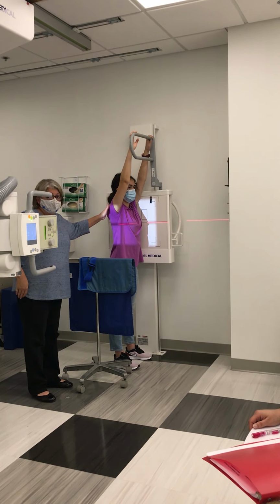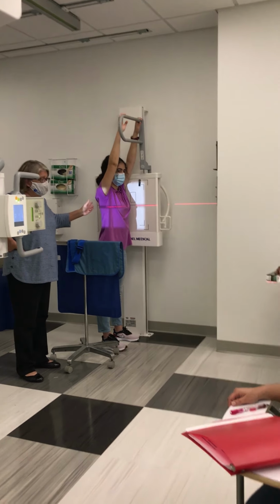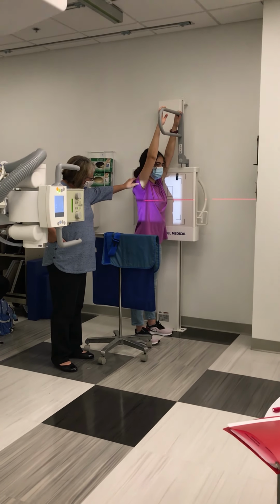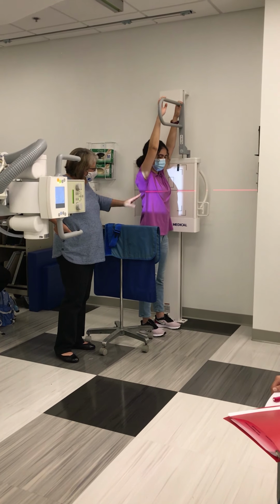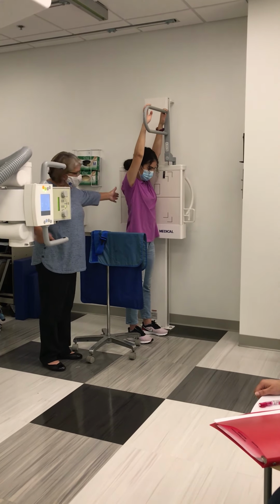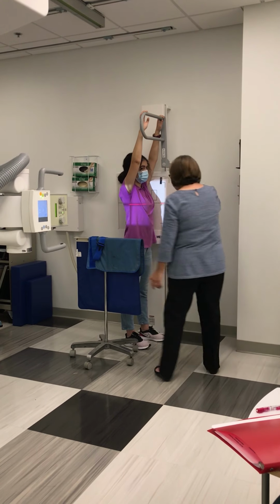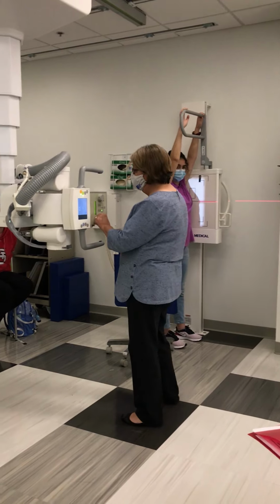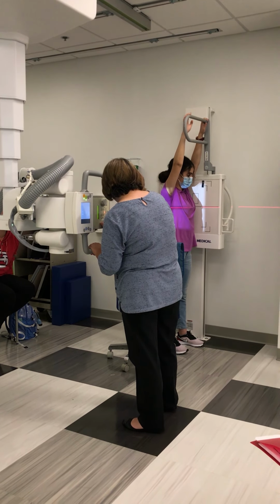I want to center at the mid-coronal plane. So I want to center on the patient. Step forward, please. This one? There you go. Now then, I'm centered anterior to posterior. I see a little light behind my patient, and I see a little light in front of my patient. Actually, with this patient, I could probably collimate in a smidgen.